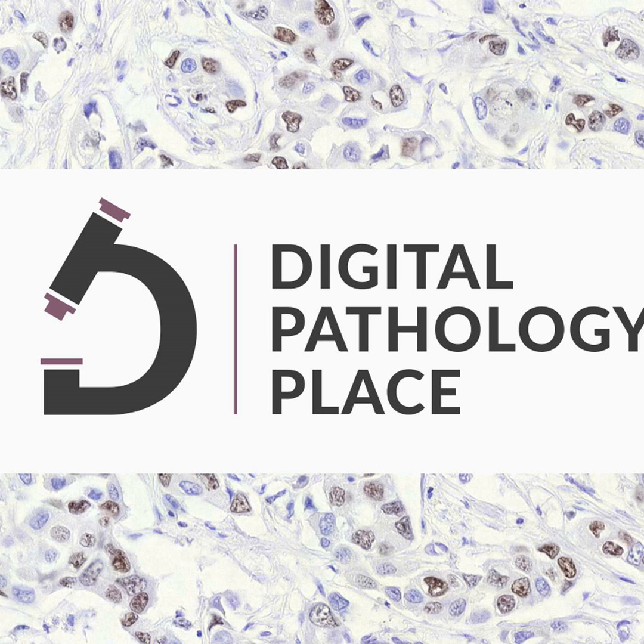from the get-go. Because, why do we need to be digitally ready? Because there is no interpretation of the multiplex IF data without digitization. So, the workflow is kind of long, right? It starts from tissue accessioning, from fixation, from all the pre-analytical stuff that goes into any pathology process. So you need to start with digital in mind when you're doing research. Maybe that's, let's say, exploratory research, maybe that's less of your focus, but when you already know which direction you're going, this is a must, because then we have problems.